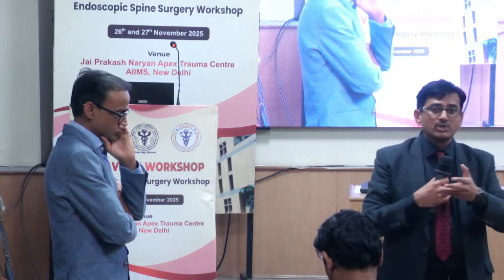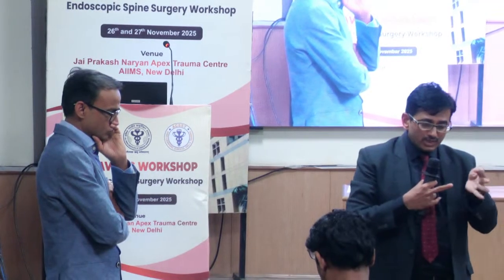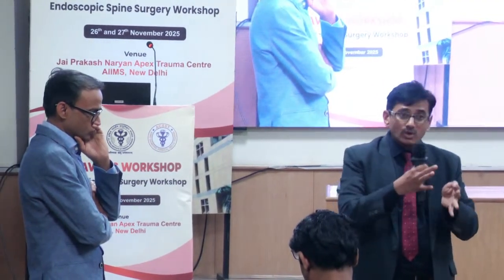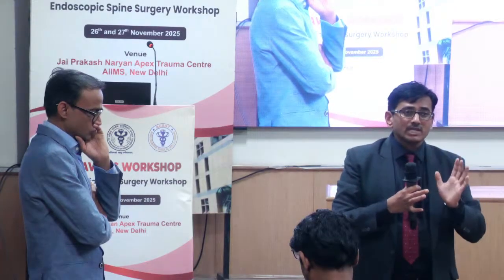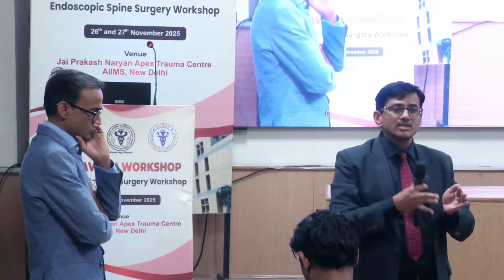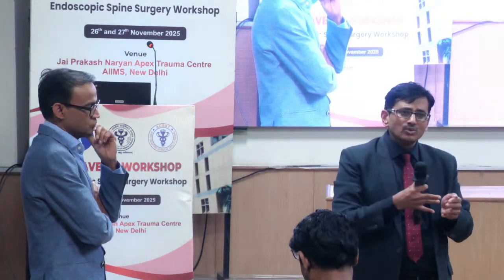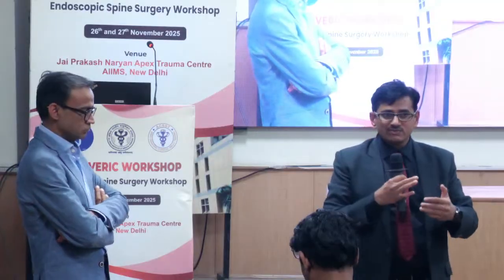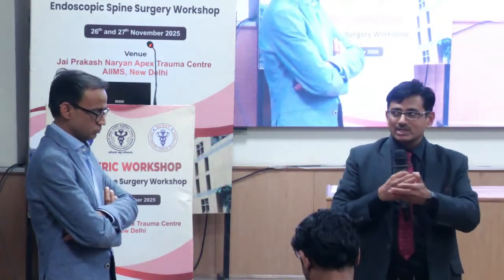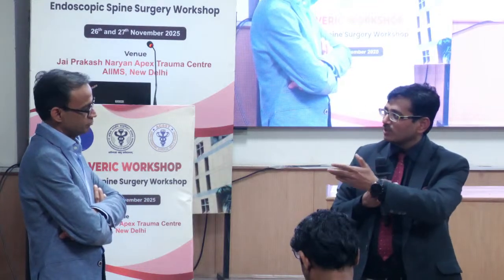With that suction, you are handling the whole tubular system like you are doing with the monoportal. Right now, the whole monoportal stand, that tower on your left hand, and with your three fingers you are managing everything, and then you have the working port. Similarly, it was the Destandau when we didn't have any other system. In Destandau you have suction which goes through that one slot, the whole Destandau together. Then you have a neuro retractor and one small working port, and through that synchrony you operate.